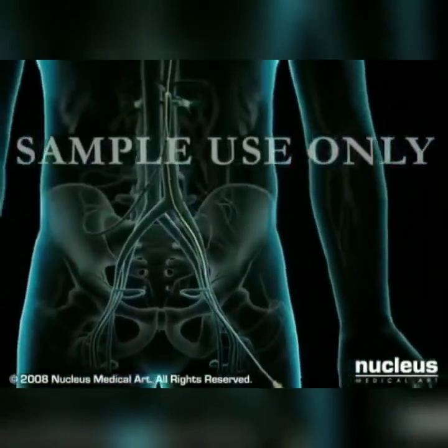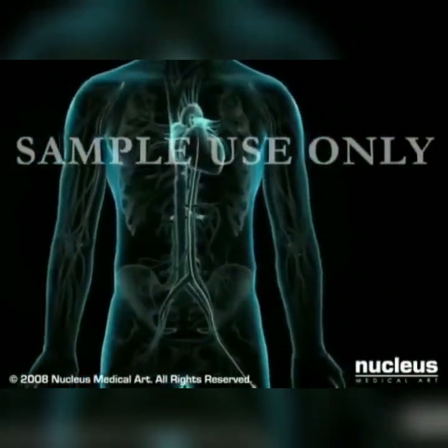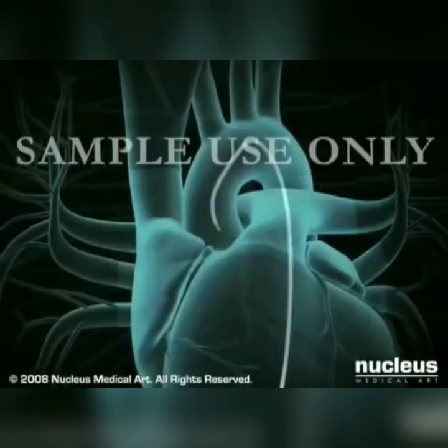Your physician will watch the movement of the catheter on the fluoroscope. You may feel pressure as the wire and sheath are inserted, but you will not feel their movement inside your arteries. To evaluate the coronary arteries, your doctor will remove the guide wire, position the tip of the catheter just inside the arteries, one at a time, and inject a special dye.